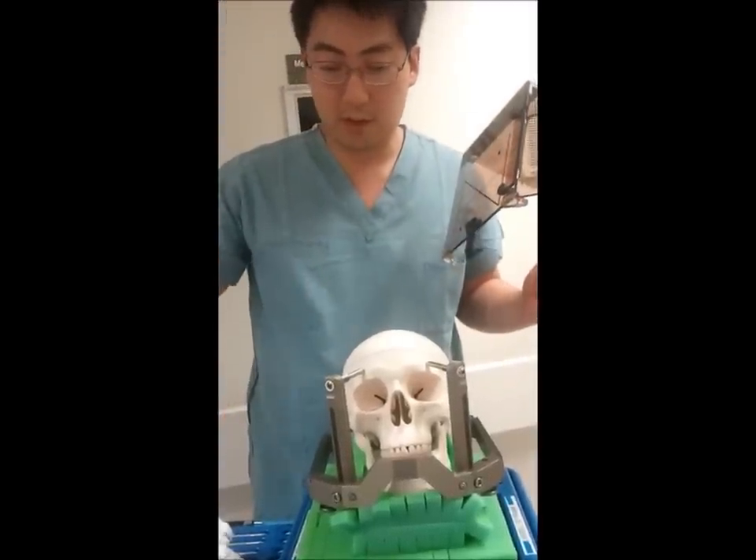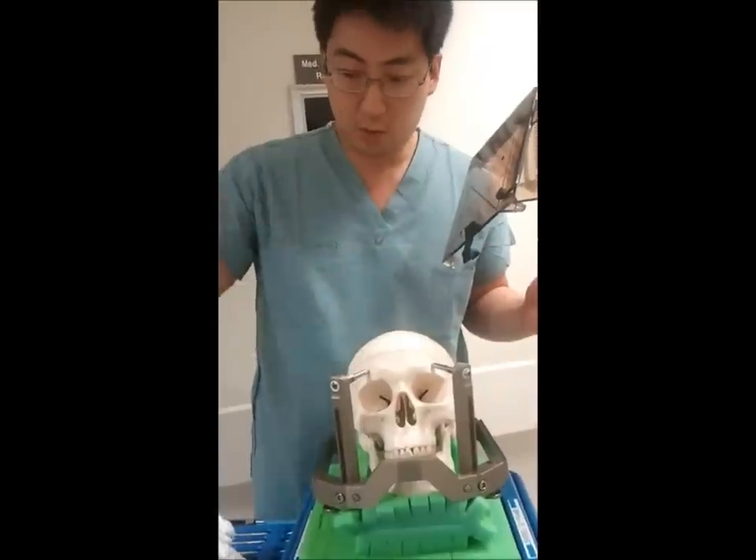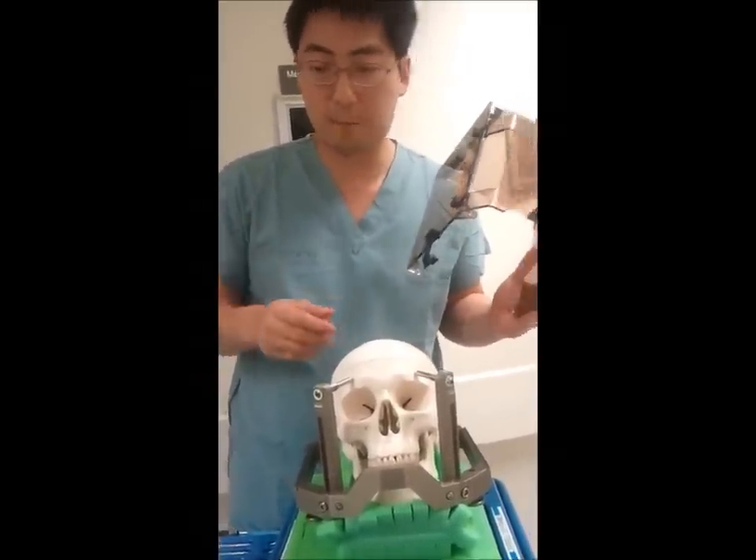For the next part, we're going to go over hooking this frame onto a Mayfield adapter and dealing with the components you'll use inside the OR. Thank you.